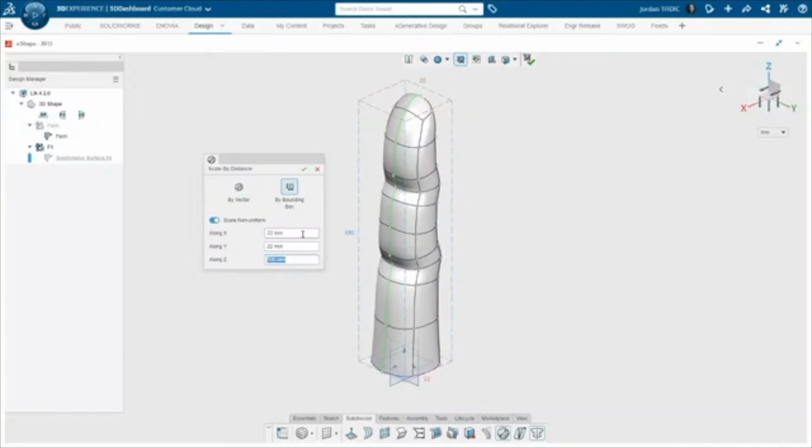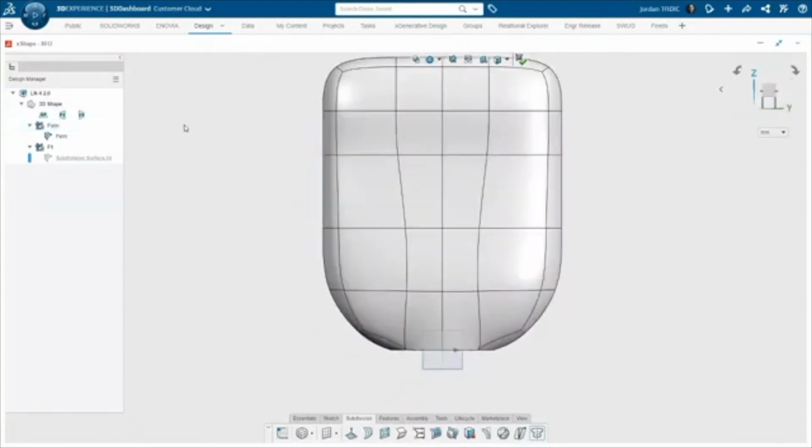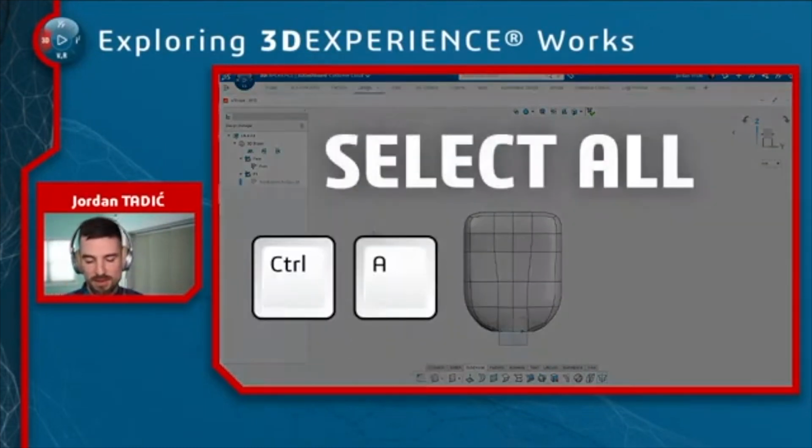Again, we had to figure out what the average size was across all the genders, across all the age groups and things like that. And that was our baseline for this design. So that's what we figured out, and that's what we input for this part of the design to make sure it was precisely the perfect starting point. Now, I just showed the palm of this model, and I realized the finger's in the completely wrong location, so I have to move the whole thing.